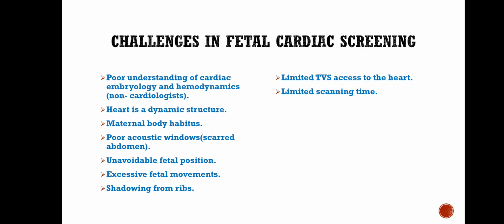Challenges in fetal cardiac screening. Many sonologists find fetal cardiac screening intimidating. The reasons are obvious. The fetal heart is a rapidly moving dynamic structure. The anatomy changes continuously throughout the cycle. Maternal obesity, scarred abdomen, unfavorable fetal position, excessive fetal movement, rib shadowing and limited scanning time often make image acquisition difficult. However, with a systematic protocol and adequate practice, these challenges can be overcome.